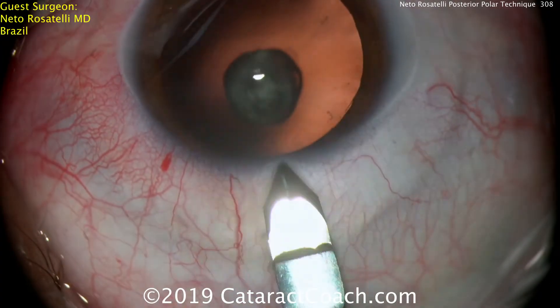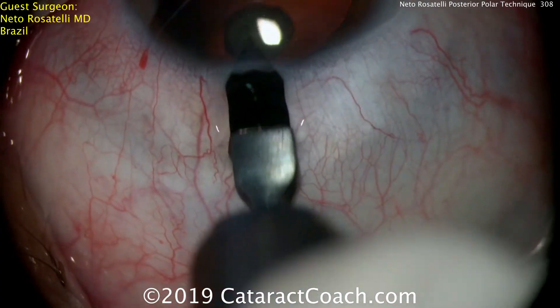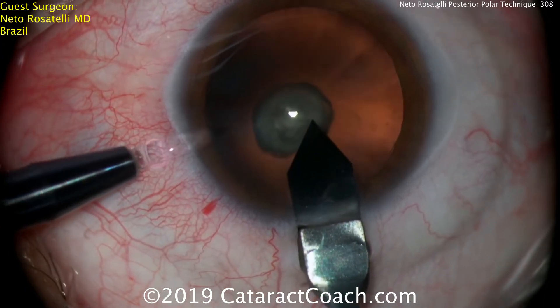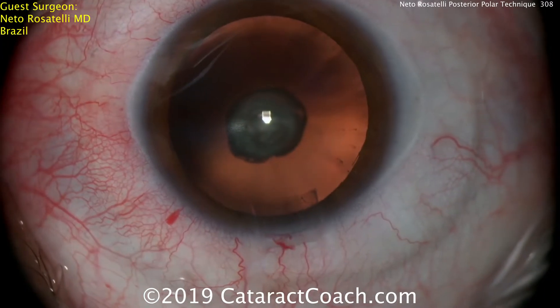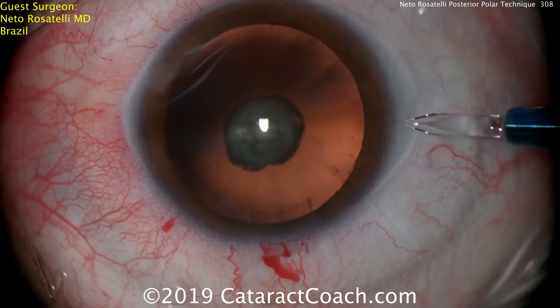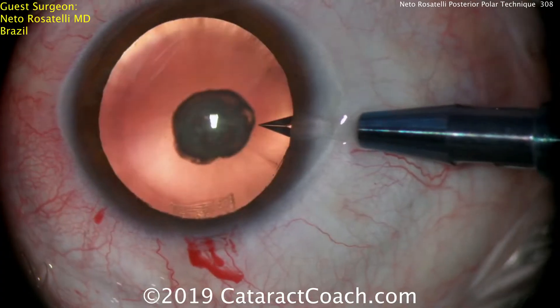Here's the keratome being used to make a superior incision. Now the blunt sides of the keratome are being used to hold the eye still while the side port is being made with a diamond. The eye is still just filled with aqueous at this point — there's no viscoelastic in the eye.